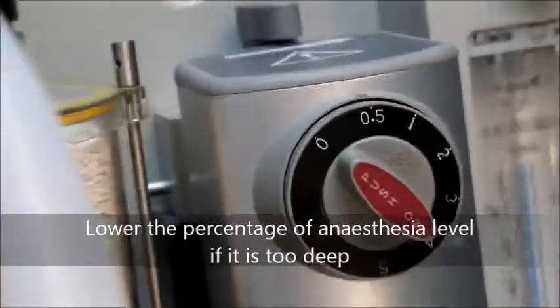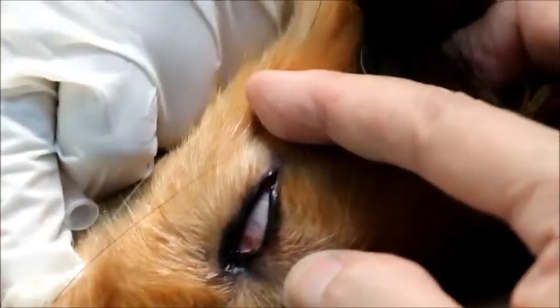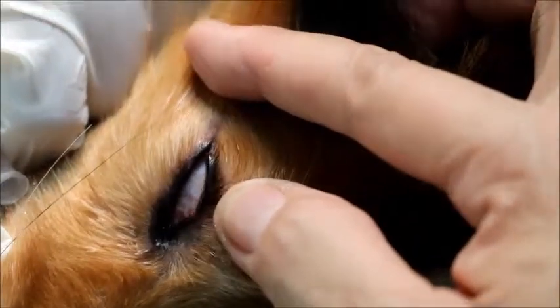Be careful. Check the eyes, yeah. It's very deep, yeah. If it's very deep, then we will drop to 0.5%. At 10:54 p.m. Very bad breath, yeah. Let's see the eyes. So the eyeball has rotated downwards. Even at 0.5%, this shows that the sedation has been effective. So the minimum anesthetic, the better. Although normal maintenance is 2%, now we are doing at 0.5%.